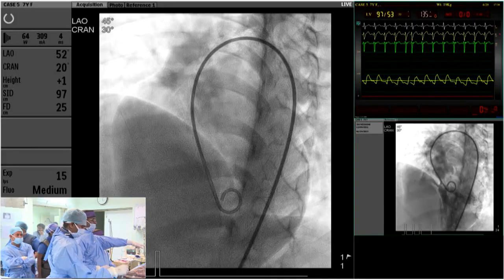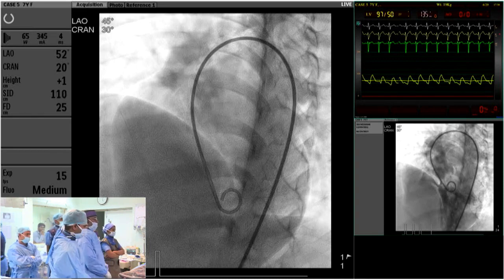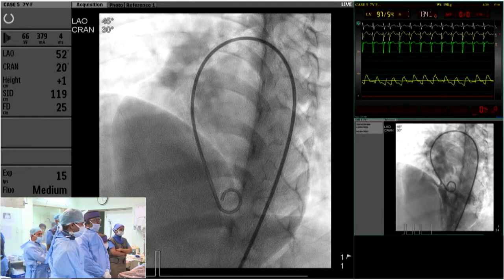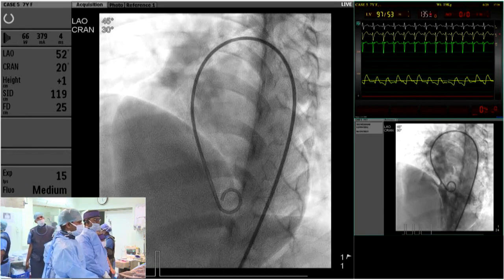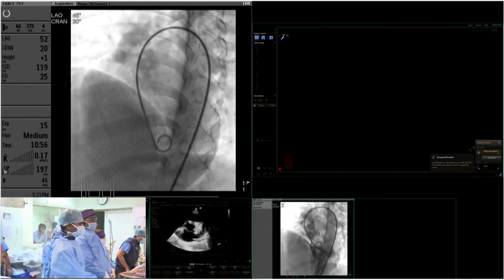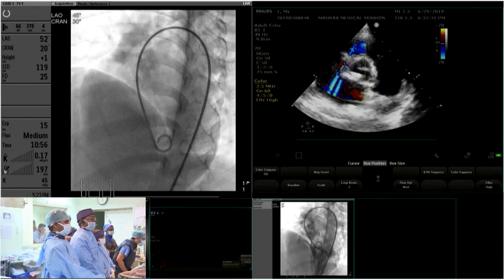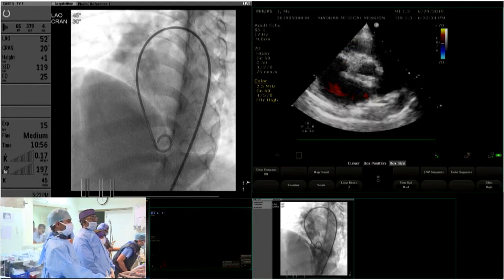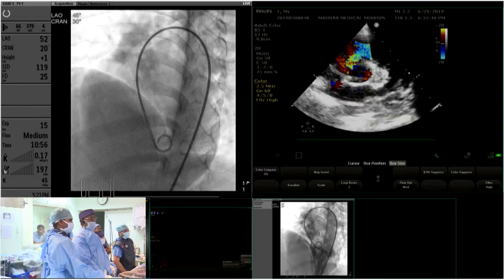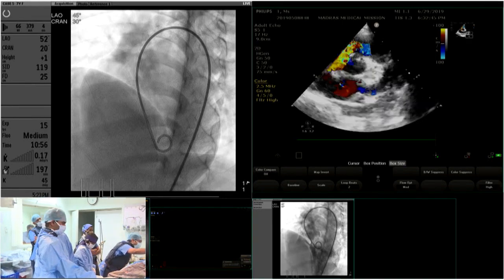We can show you a live short axis view. Get on quickly to your left short axis view. Dr. Santosh, my colleague, is going to show the echo. Make the echo big, echo on the screen. Put the color there, get the VSD out. It's more posterior. Yeah, so that is the place where the VSD is coming off from. Get a sharper quality image. The person on the right can take over the probe.